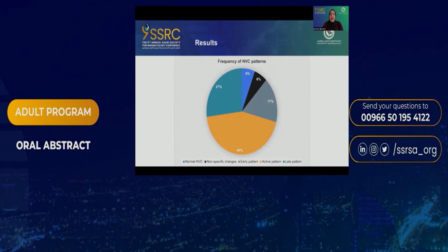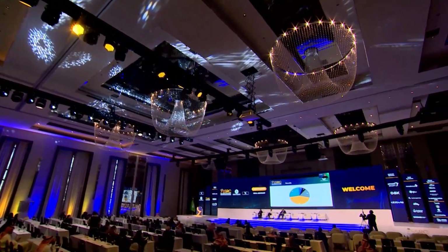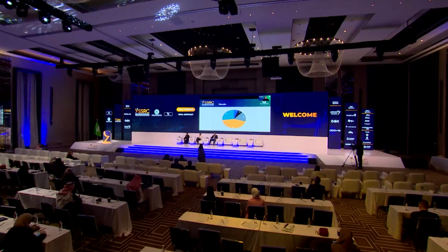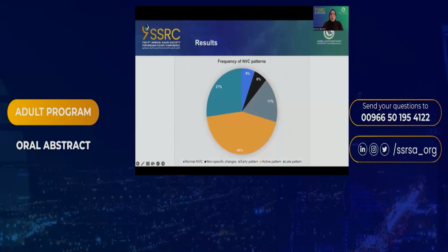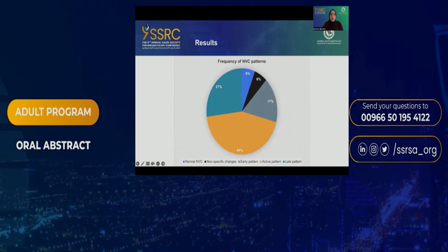44% of patients had the active pattern on nail fold videocapillaroscopy, and 27% had the late pattern. So together, 71% had the severe pattern on their evaluation. 17% had an early pattern, and few had normal or non-specific changes.